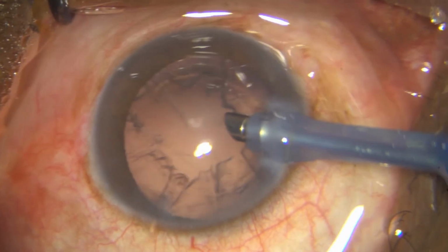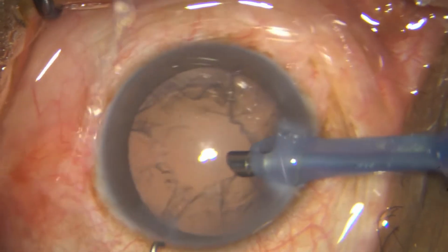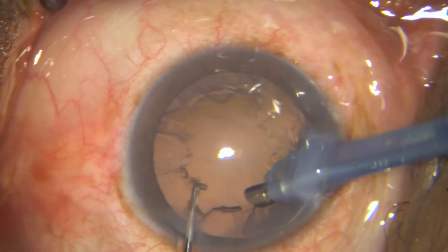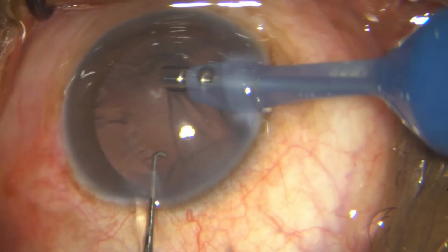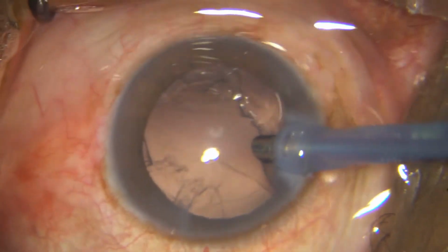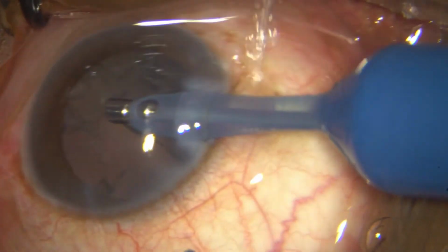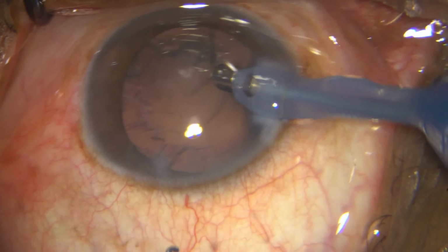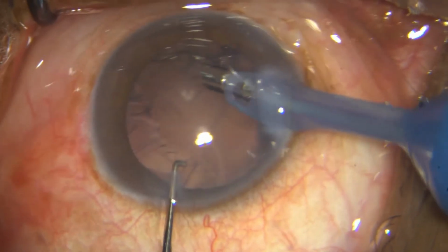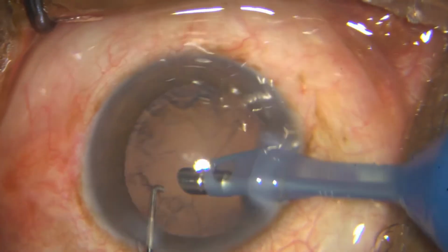And now I have switched on to aspiration mode, and my parameters are 250 millimeters vacuum and 20 ml flow rate. Very low parameters. And try to keep your bevel facing down. Try to occlude the bevel with the cortical matter when you are doing this step. Be very careful and use your second instrument only if needed, because you don't want this chamber to shallow.